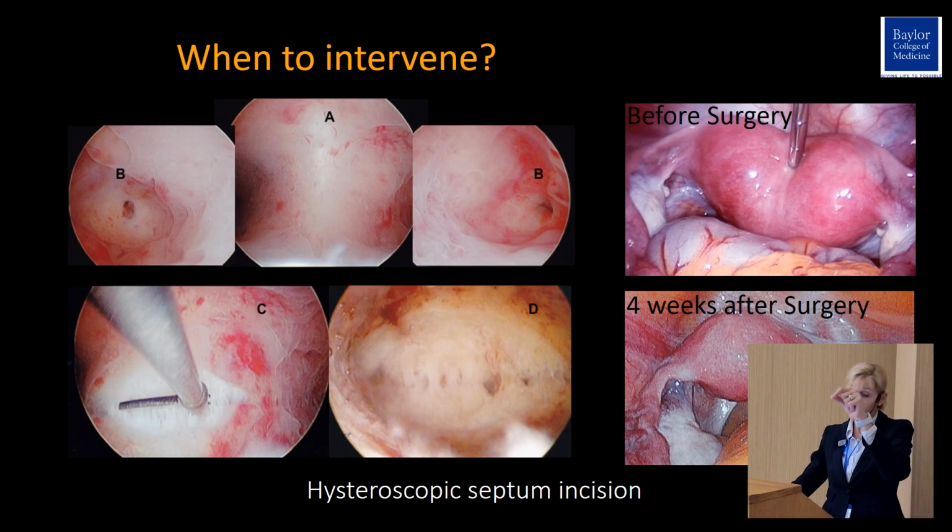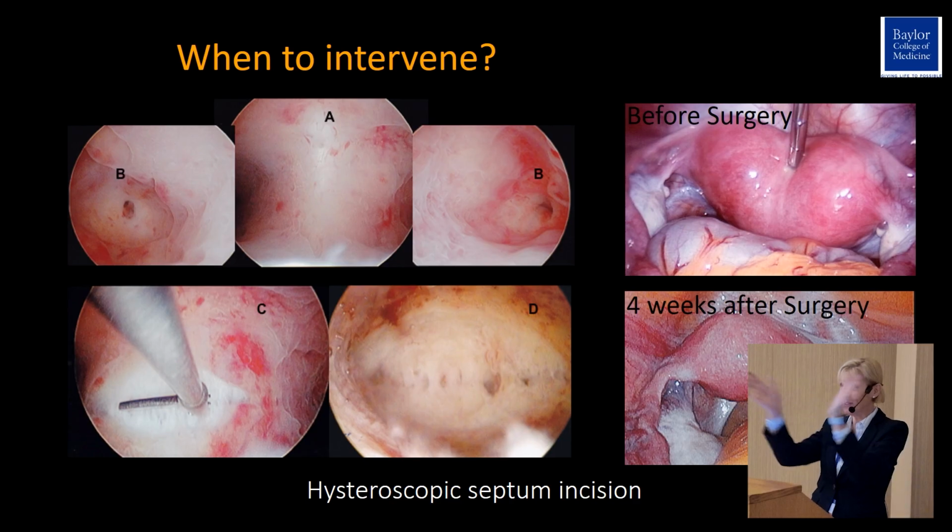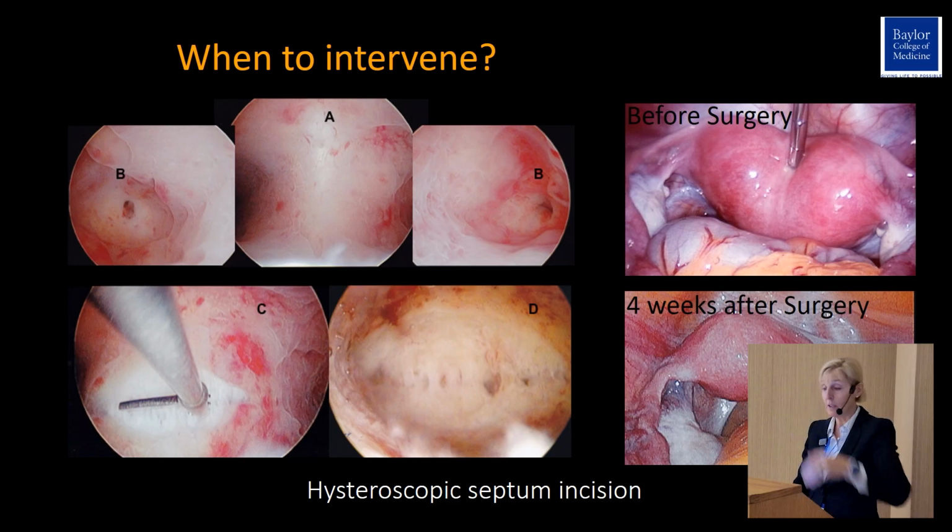So if you're with me doing a hysteroscopy for a septum, you might become seasick, because the uterus being very wide, I constantly come back and forth looking for the ostia to make sure that I'm at the right level, especially when I start touching the fundus of the uterus.